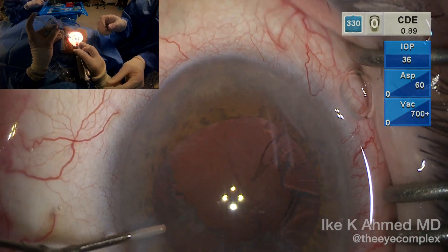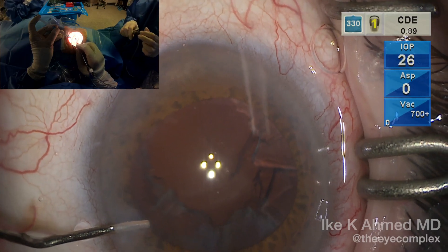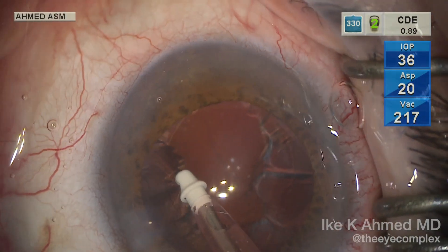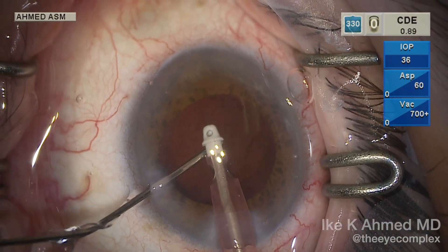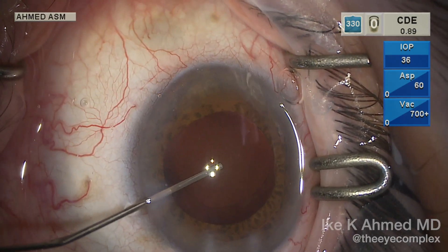Notice this is a combined case during phaco. Before we come out, we inject saline into the eye to avoid further blood reflux. I should mention that we did perform the excimer laser procedure here prior to phaco. We find the views the best, the globe's firm, and we have the best chance for creating visibility.